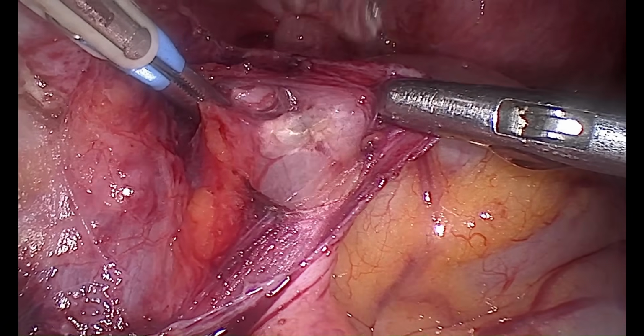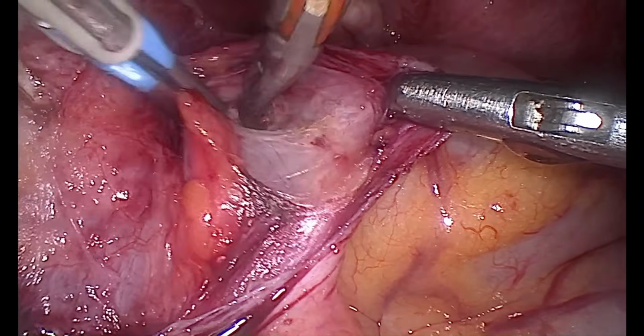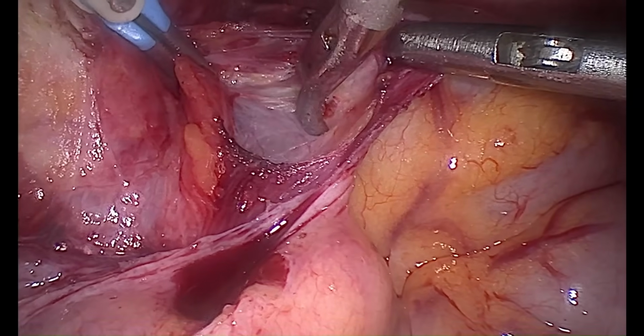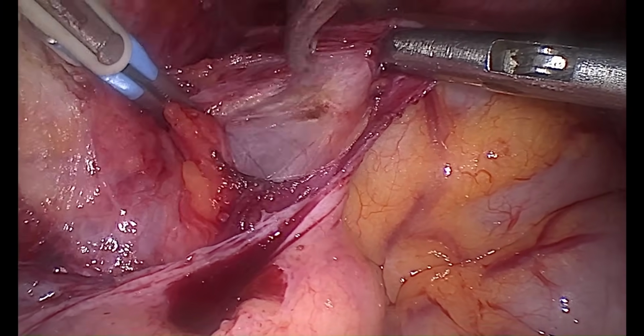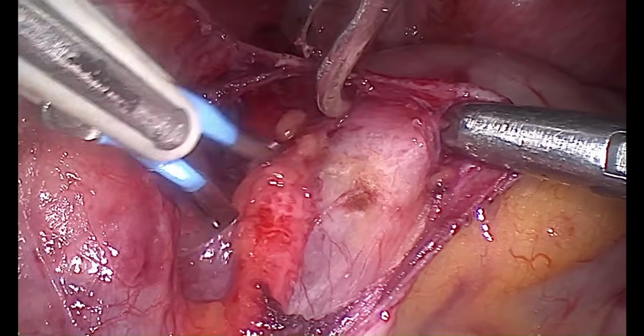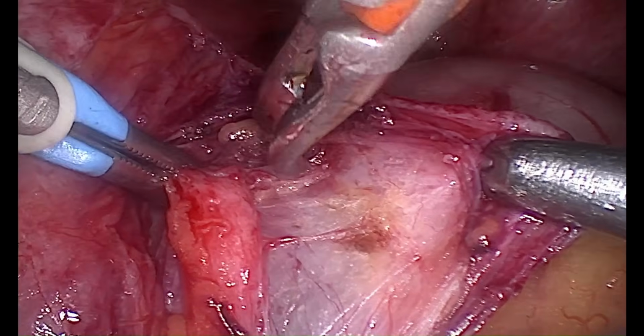These are the microcapillaries. It is always advisable to first dissect more and then coagulate, and activate any energy source in order to prevent damage to the ureter. Usually, the color of the ureter will show you the integrity of the vascular supply, and the movements of the ureter will also be helpful.